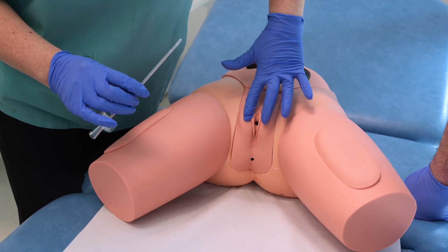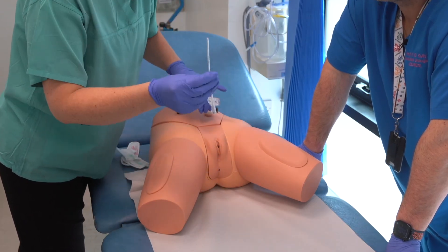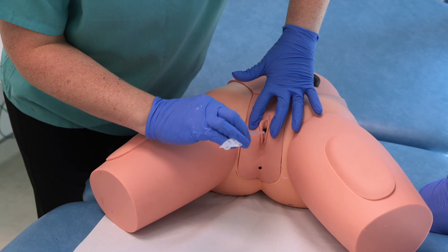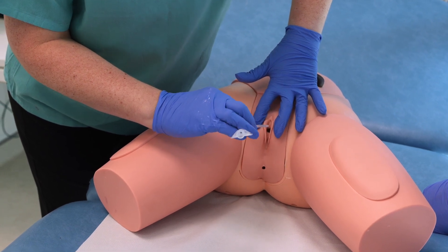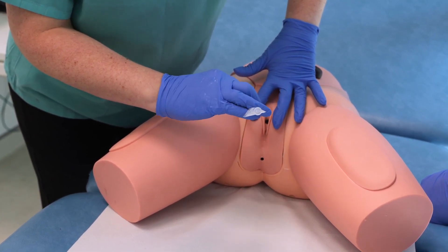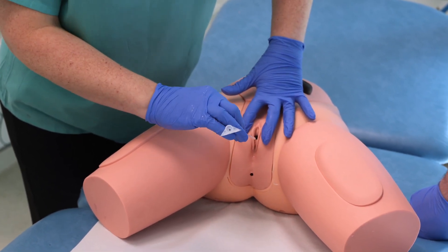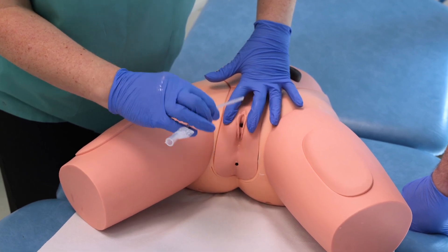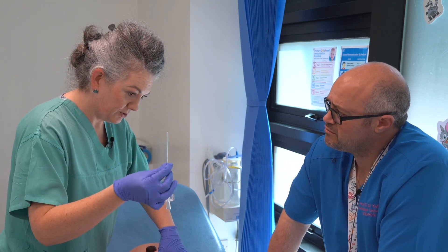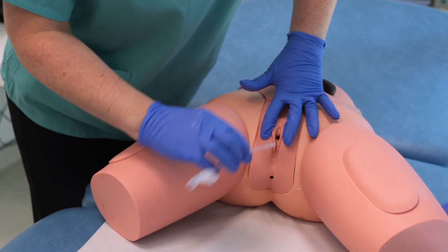Gently open and lift to expose the urethra. With your dominant hand holding the catheter, look for the urethra — it's generally up higher, the vagina is lower. The catheter will slide through the urethra easily; if there's major resistance you're not quite there. If you insert the catheter and nothing drains, there's a chance you've gone into the vagina — that's okay, just remove it and use a clean catheter so you're not introducing vaginal flora up into the urethra, then try again.